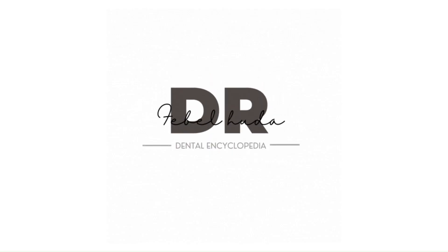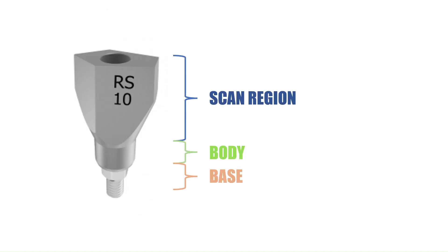Welcome to Dr. Fabel Huda's Dental Encyclopedia. The main component required for making this impression is a scan body. The scan body has three parts: a scan region, a body, and a base. Now we're going to see a short video capturing all the steps of how to perform a good digital impression.